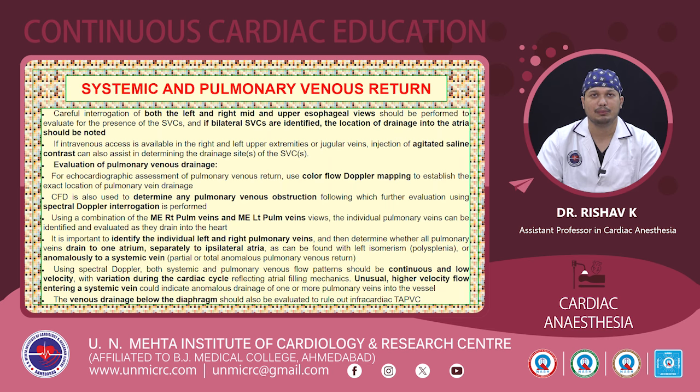Now for evaluation of pulmonary venous drainage, we have to perform firstly color flow Doppler mapping to establish the exact location of pulmonary vein drainage. Also we can use color flow Doppler to determine any pulmonary venous obstruction, following which further evaluation using spectral Doppler interrogation is performed. Using a combination of the right midesophageal right pulmonary veins and the midesophageal left pulmonary vein views, the individual pulmonary veins can be identified and evaluated as they drain to the heart.